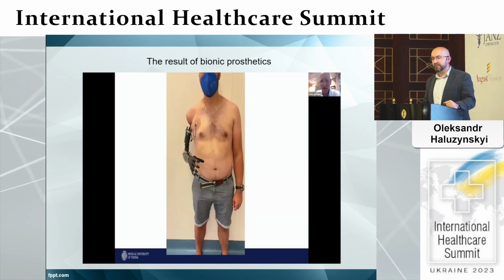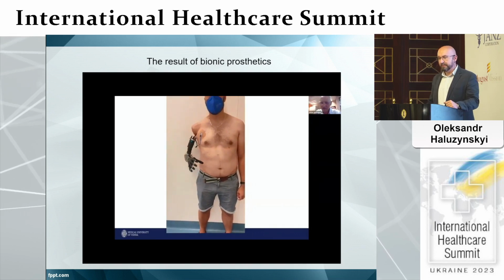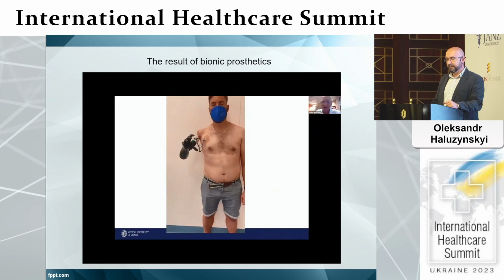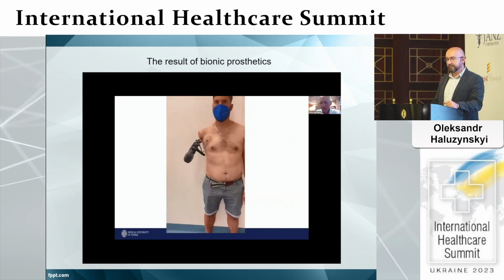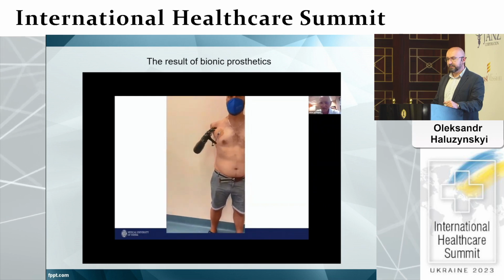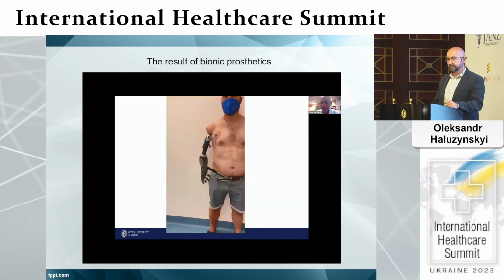Similar solutions and visualization in a patient who had his upper shoulder operated, and this was performed in a clinic in Austria by Professor Dr. Aszmann. Way he addresses that arm. Now, obviously, we want to get away with the cables, and I think anybody who's active in the field is trying to get that done, but it's not so easy.